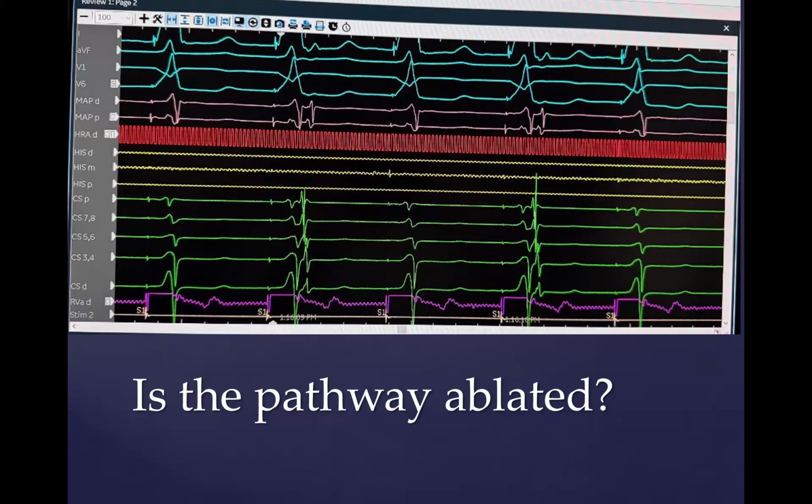That is generally considered to be a good combination of both power and temperature to achieve a good goal of blocking a pathway. But when you are in the coronary sinus, there's very little blood flow. All you're seeing really is the venous return of the coronary arteries. And so there is very, very little cooling of the catheter when you're in the coronary sinus.